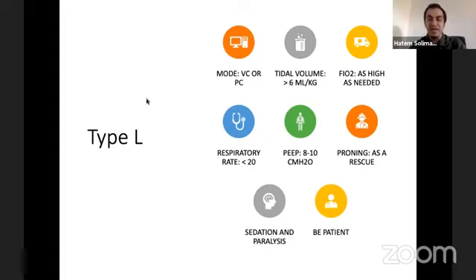So patience is very important, and we noted that these patients usually stay on the ventilator at least 7 days, and ideally 10 to 14 days, even if they are requiring lower FiO2. But it does not necessarily mean that these patients are ready yet for extubation. And I found that lung ultrasound can be useful and guiding in this setting. I have seen several patients with improving FiO2, 35 to 40%. And when I scan the lungs as part of my daily assessment of these patients, I still see a significant degree of alveolar edema and curtain-like B-lines across the lungs, which is an indicator of the level of aeration.